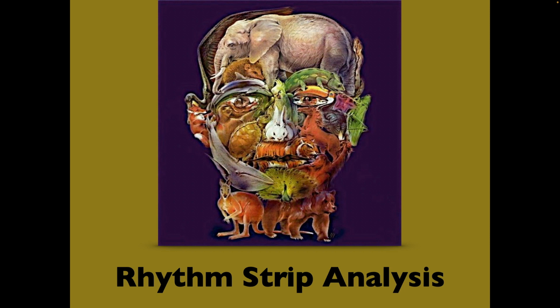Excellent, okay. And then, Grace, what does the QRS represent? Depolarization of the ventricles. Perfect. So ventricular depolarization, correct. Okay, and Natalie, what is a normal QRS? Less than 3 boxes. If you were to say that in seconds? Less than 0.12 seconds. Perfect.